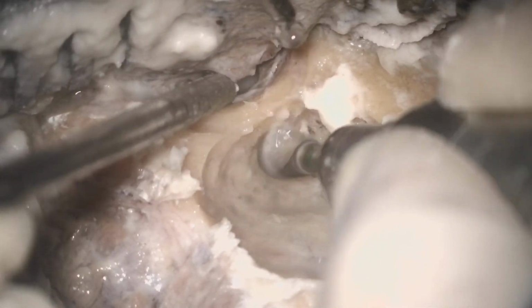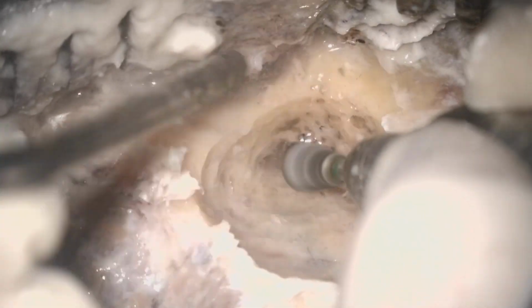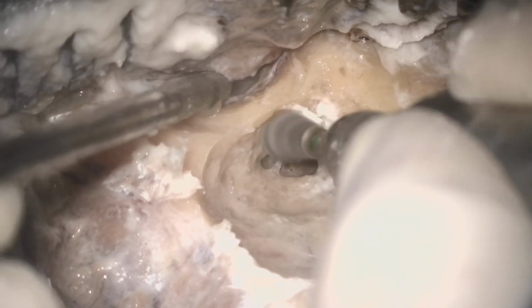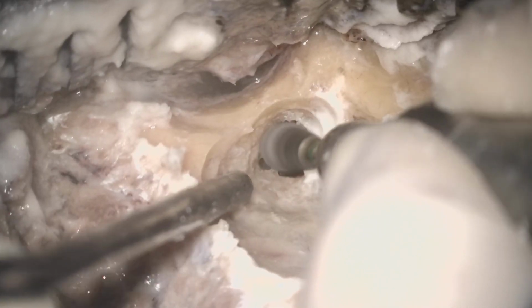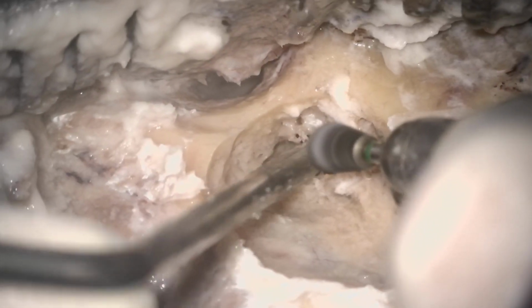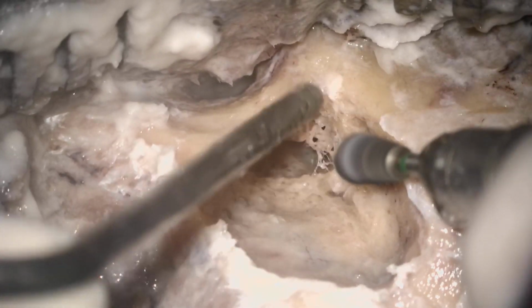If you are going for a cortical mastoidectomy for cochlear implantation, or if you are going for facial recess surgery for any other reason like glomus surgery or combined approach tympanoplasty, then the canal wall should be absolutely delineated. Okay. So these are all cells, and after that you will actually get the canal wall. Otherwise you cannot delineate the facial recess because it will obscure the view of the facial recess area.